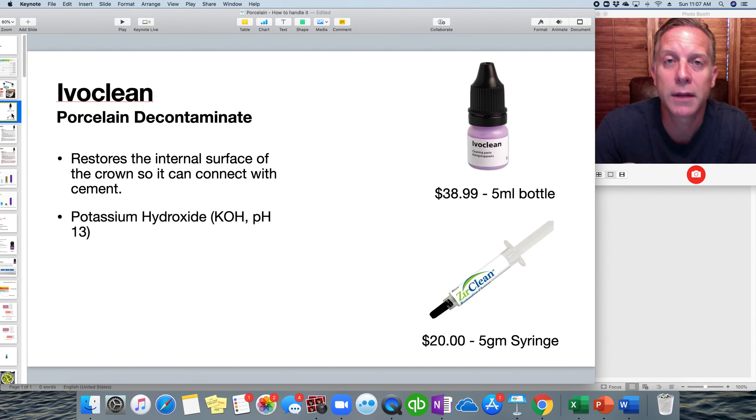Instead of sandblasting, we use Ivoclean to clean the internal of lithium disilicate restorations, and we also use it on zirconia. It's a porcelain decontaminant. Whenever you get a crown from the lab, or if the patient has lost a crown and you try it in to make sure everything fits well, saliva gets inside the crown. Saliva contains a lot of phosphates, which bind to the internal surface — especially zirconia — and can reduce adhesion. So you want to decontaminate it completely.